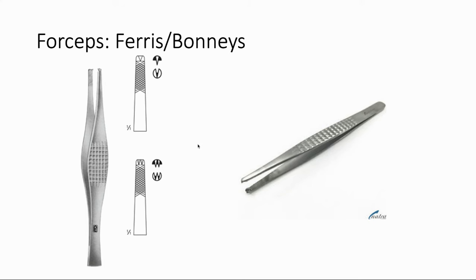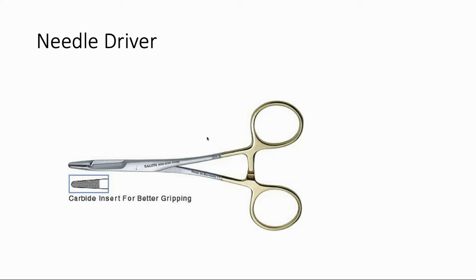Here we have the needle driver. This is what we use to hold needles and actually do the suturing, and obviously there are many different kinds depending on what sort of suturing you're doing. The key thing to know as a medical student is that these look a lot like clamps or hemostats, but they do have a finer tip and some traction on the end to make your needle less likely to slip. While it looks similar to a clamp, you wouldn't want to use a clamp to suture — you want to make sure you have a needle driver.